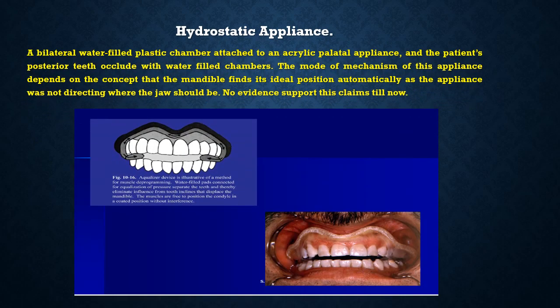Another appliance is called the hydrostatic appliance. It is actually bilateral water-filled plastic chambers attached to an acrylic palatal appliance, so that the posterior teeth of the patient will occlude against a soft water-filled chamber.